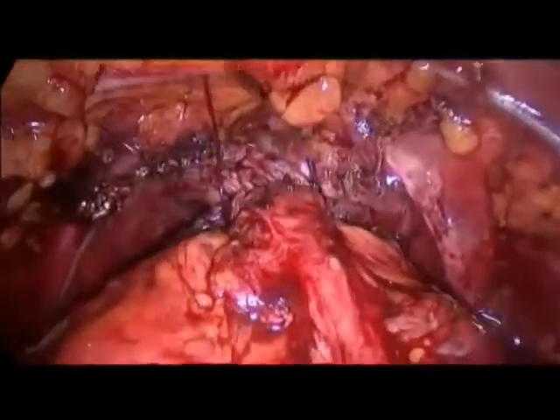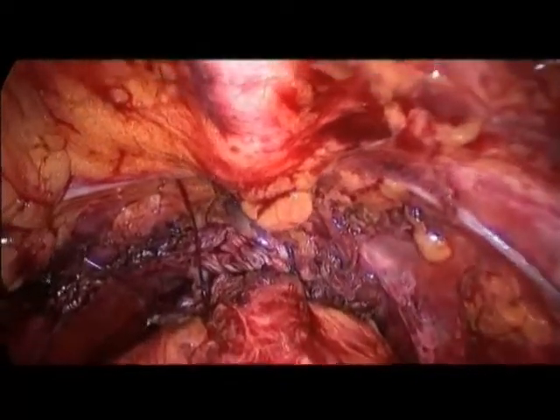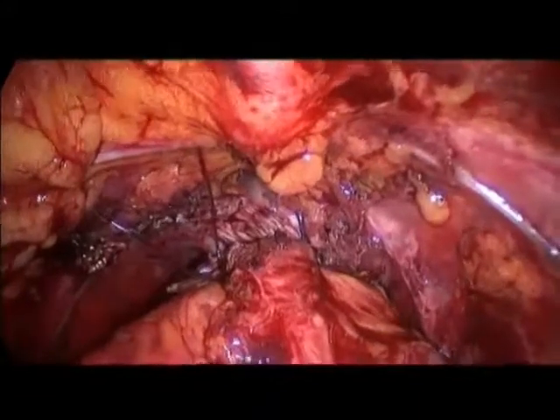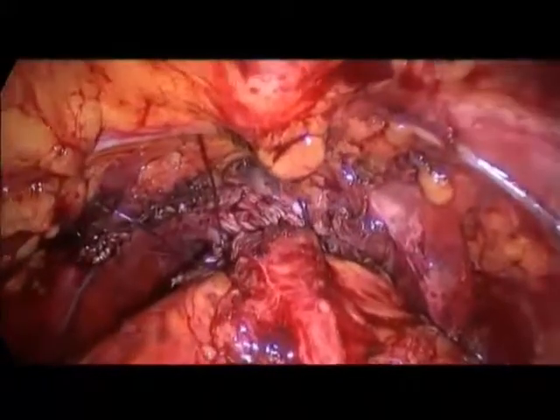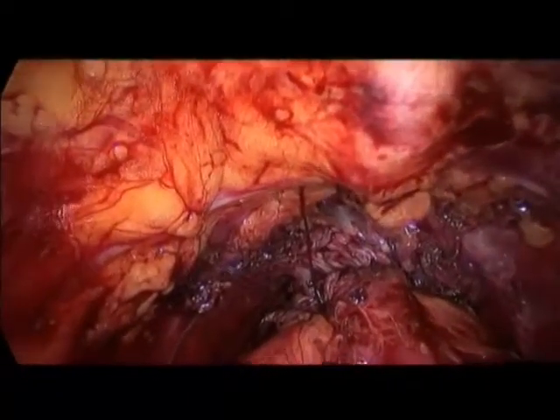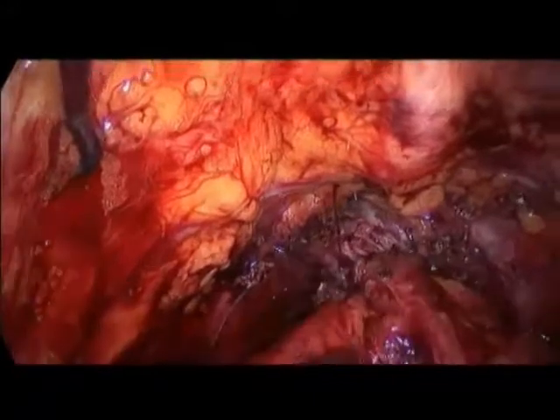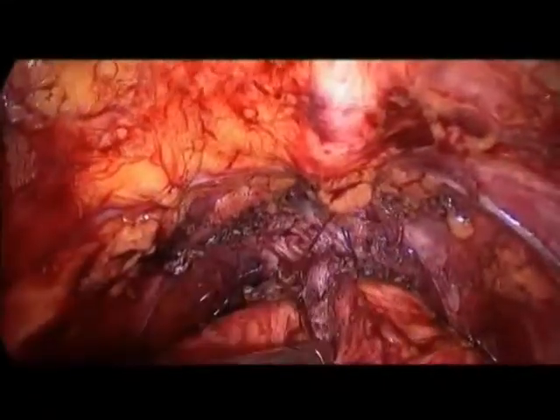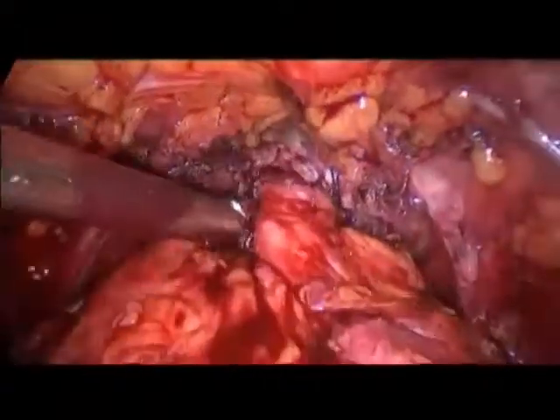No, I'm not happy with that catheter. Deflate. I don't know where I am. I didn't see the balloon coming. We were not in the bladder. Have you taken out the catheter already? Not yet. We have a very rigid catheter, which is not good for this anastomosis because it's too straight and goes straight posterior. For such situations, we have developed a catheter with a central perforation so that you can insert a guide wire and manipulate this into the bladder if you are in doubt.